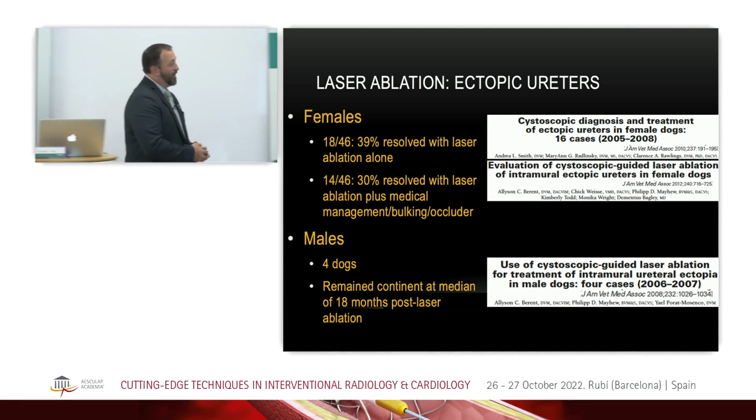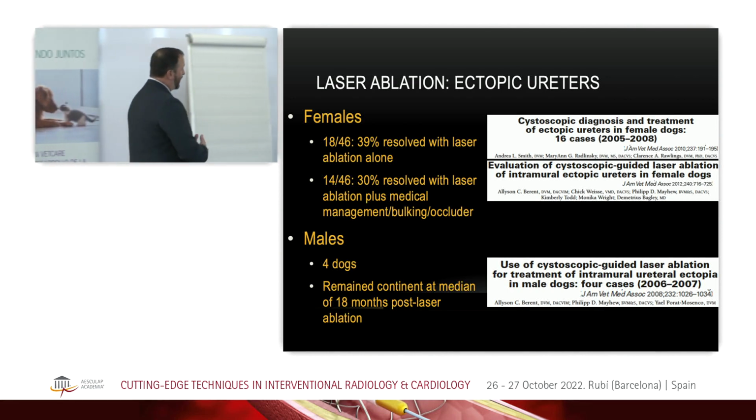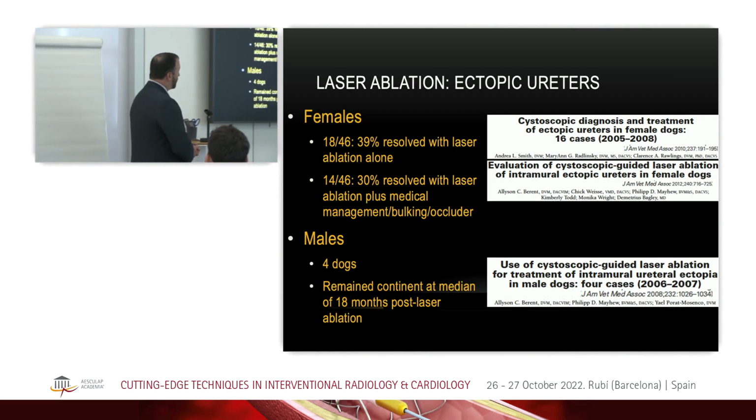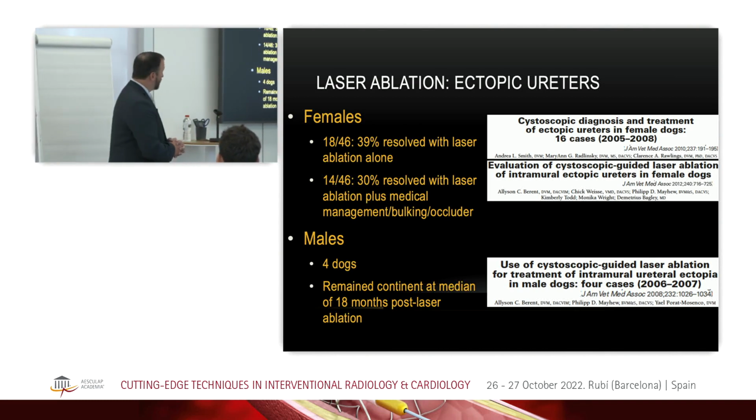We usually see it diagnosed more commonly in females, likely because males, probably with their longer urethra, tend to tolerate it a little bit better or show it less. But there are some males that we see as well. And again, for male dogs, we would do that perineal approach to be able to do this procedure.